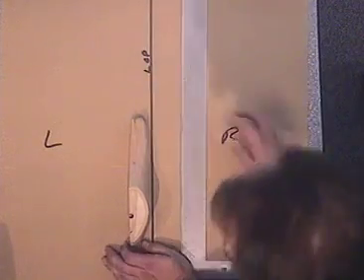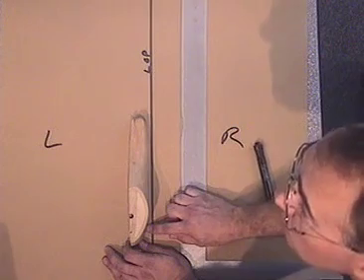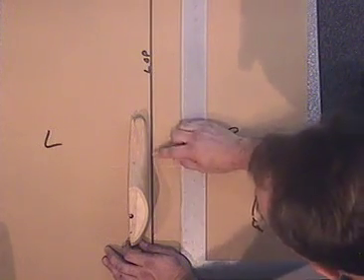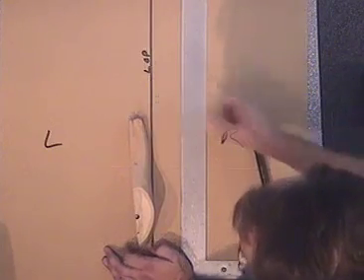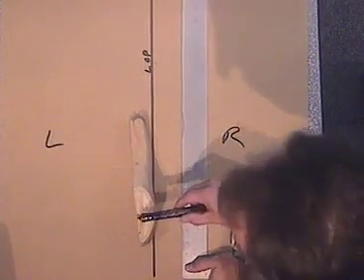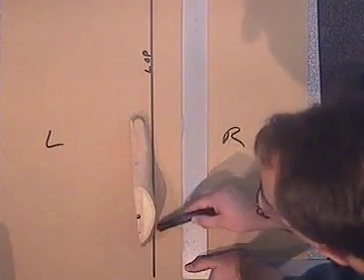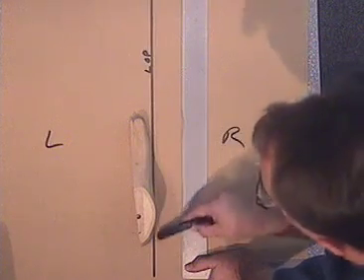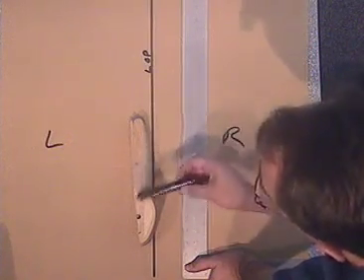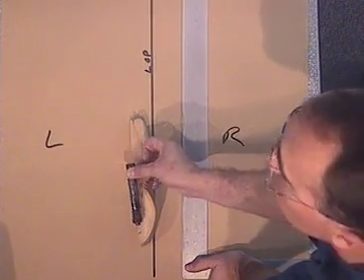Now, if we go to put in 5 degrees of toe out, what we're going to do is bring this medial border of the foot over to the line of progression. You can see how that angles that line now. And now this line is actually at about 5 to 7 degrees of toe out. So if the medial border of the heel and the forefoot by the metatarsal head is parallel or on the line of progression, we're automatically going to have about 5 degrees of toe out.